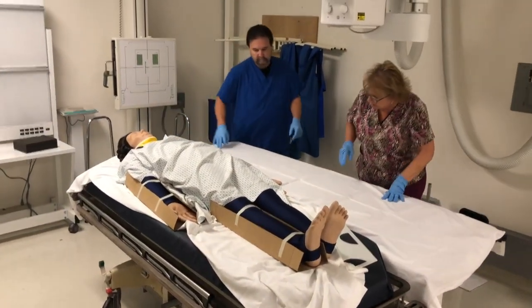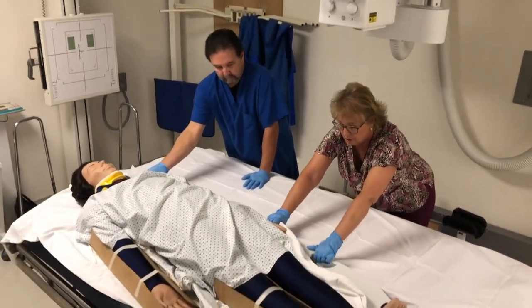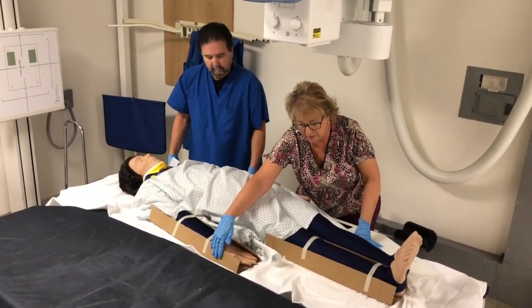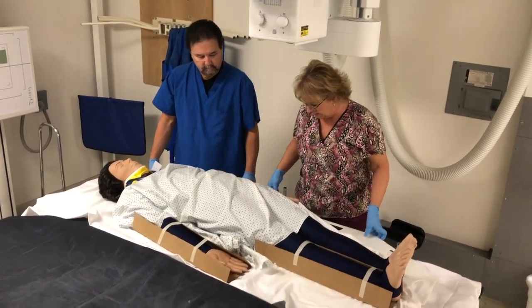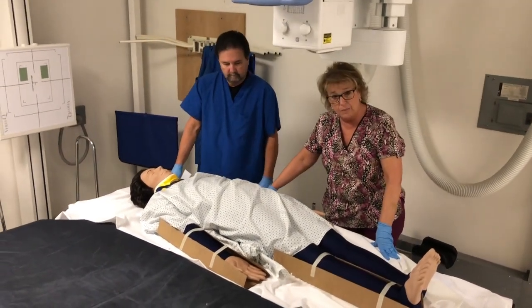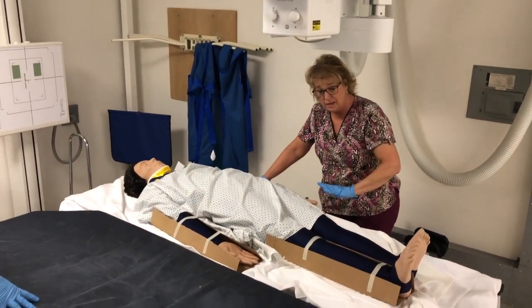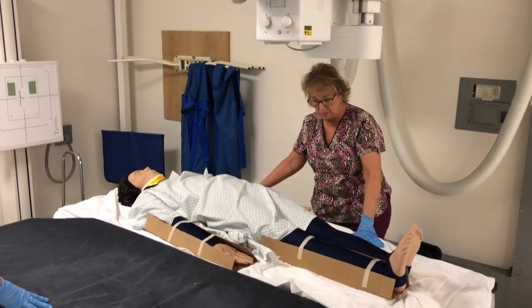And so from here, again, someone would be at the head of the patient, and then we would use the slider board to move the patient over onto the table. And when there's a fractured limb, you might also have someone just supporting that limb by itself. Now, I normally will keep a patient on the slider board just because it's more trauma to the patient to roll them again to get them out. And so I just keep the patient on the slider board.